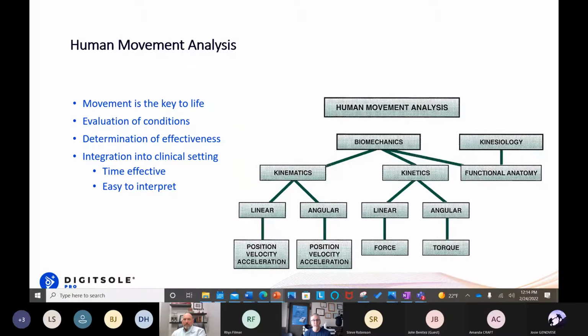We're trying to get people to move better, because that's associated with getting them better overall in life. So we utilize human movement analyses to determine what type of condition, looking at the course of a pathology. Depending on the systems and approaches that you're using in the clinic, they have relative sensitivity. So they may even lead us down a path of determining exactly what that diagnosis may be. But again, that's still part of that health or wellness perspective, but in the physical movement.